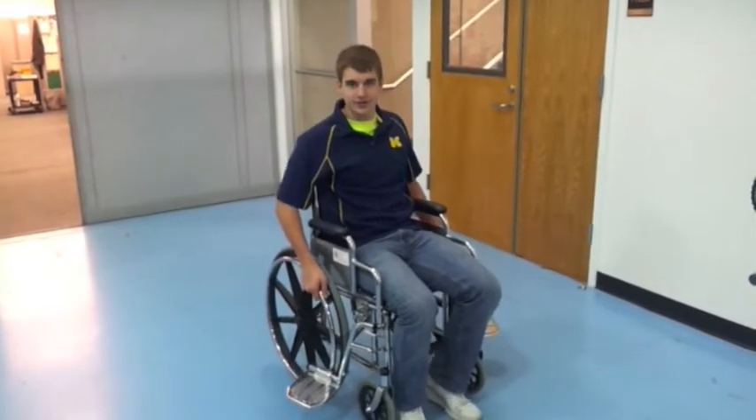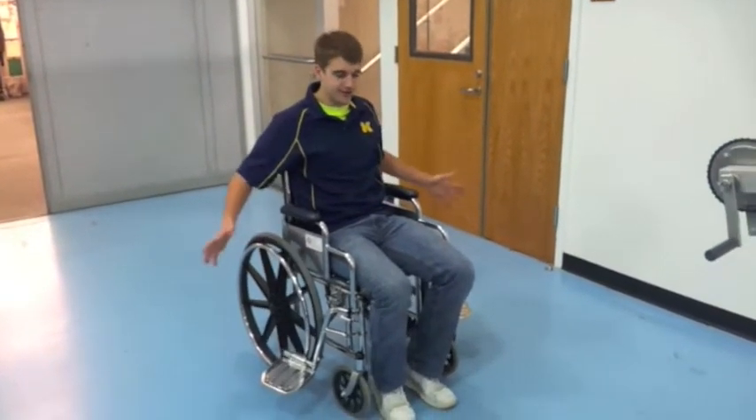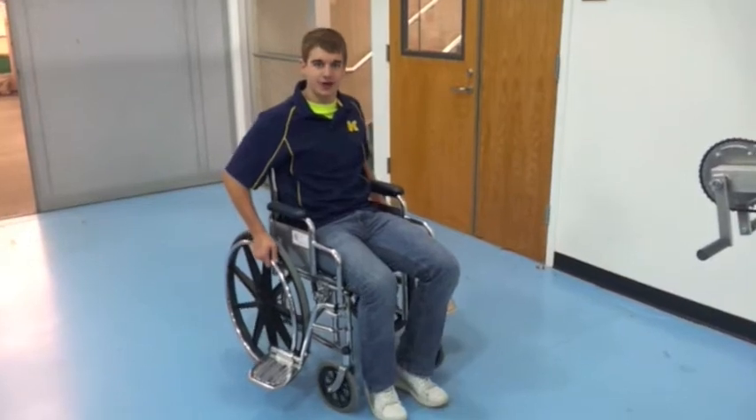This is our hand operated paraplegic exercise bicycle, or HOPE-B, that me and my team created this past semester for ME450.